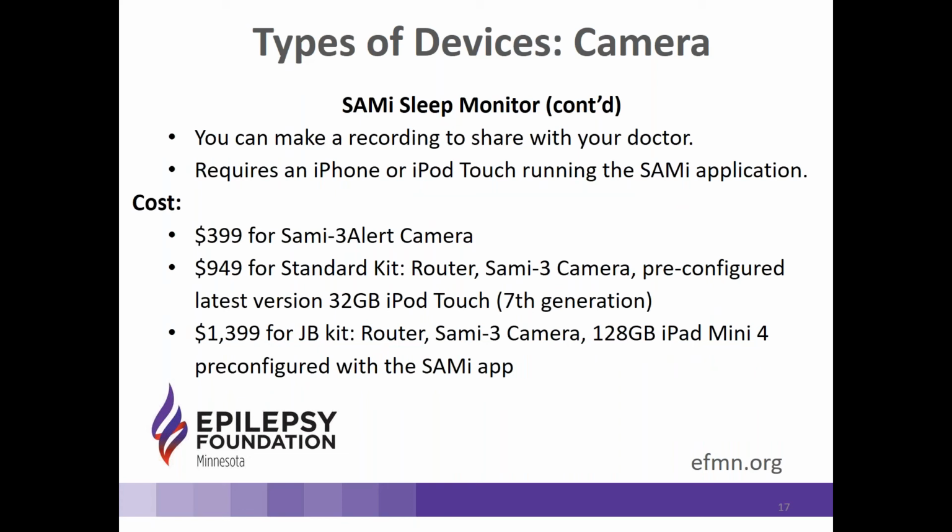So when that records, you can then make a recording to share with your doctor. So that again can be a really useful thing. It does require that you have an iPhone or an iPod Touch running that SAMI application. So this is an Apple-based system, and depending on how you feel about Apple, that may be a plus or a minus for you. Some people love Apple products and some people hate them. So again, something to consider in choosing your device.